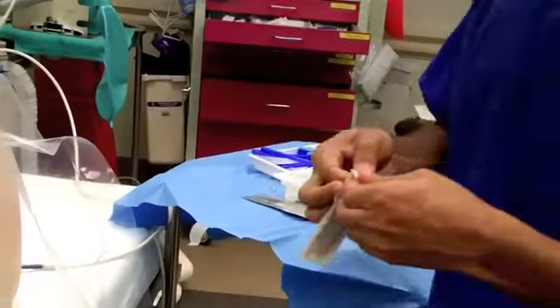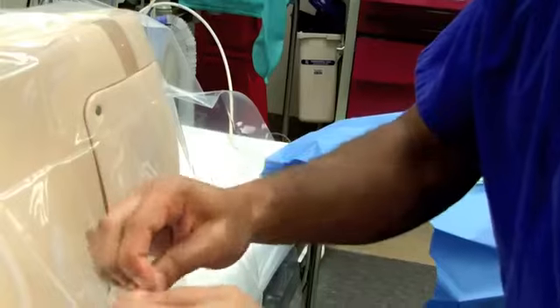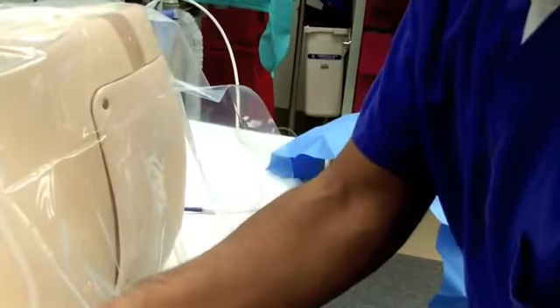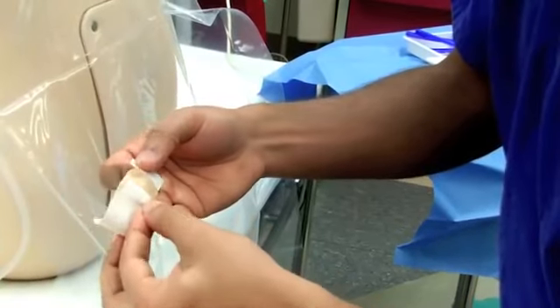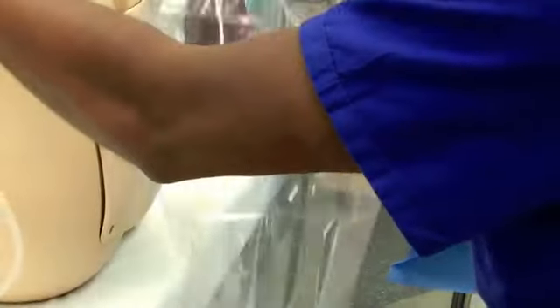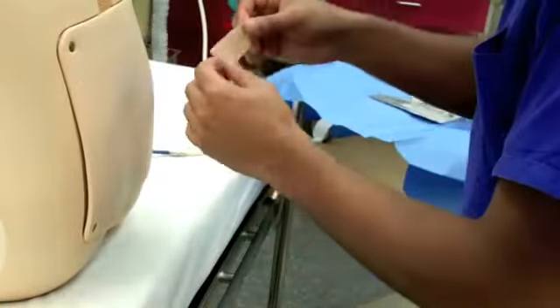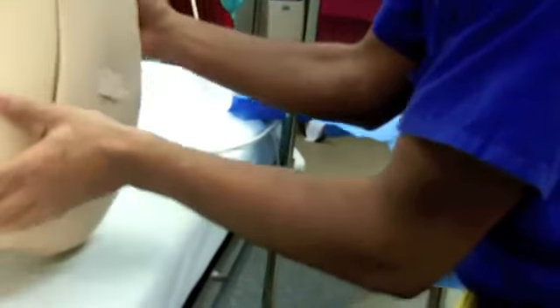The area is no longer sterile. And we're going to lay the patient in the lateral position.